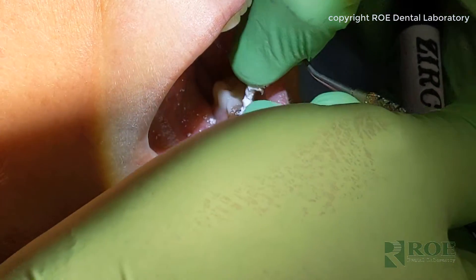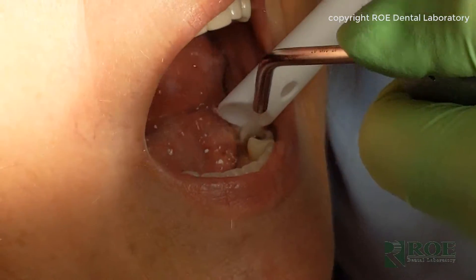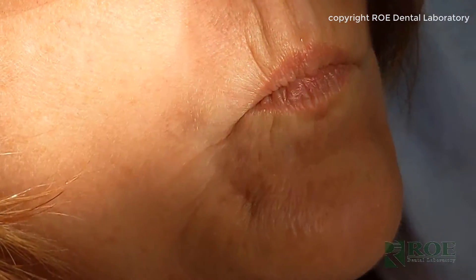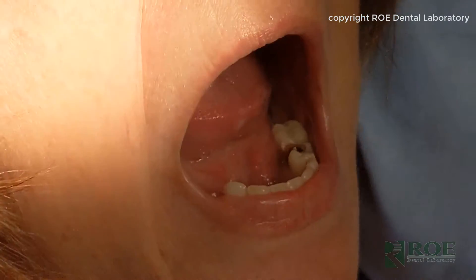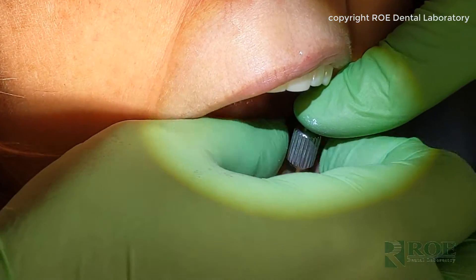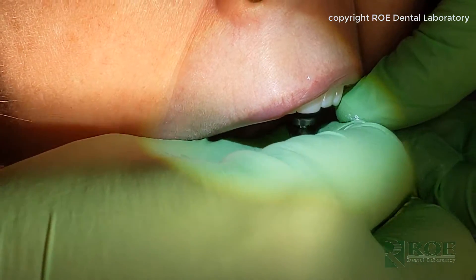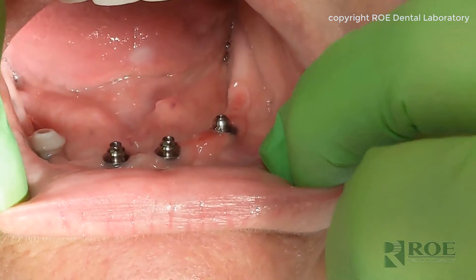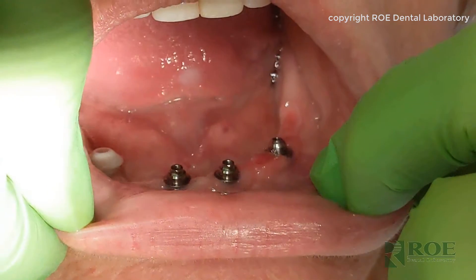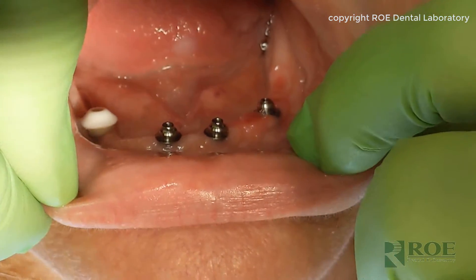All right, we are doing an iJIG. The first step is to remove the patient's existing prosthetic. Remove the screws — these are just hand tightened. That's three multi-unit abutments and one healing collar. And on the back left, patient's right, we're going to pick up that site in a new temporary cylinder.